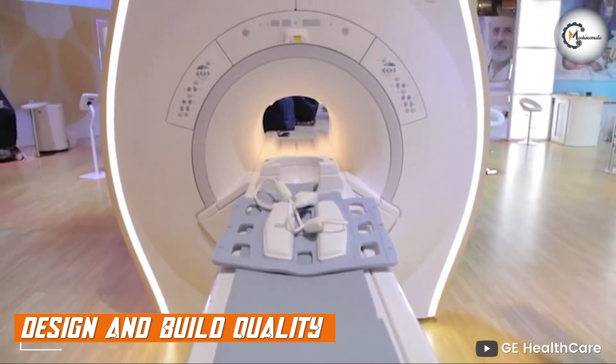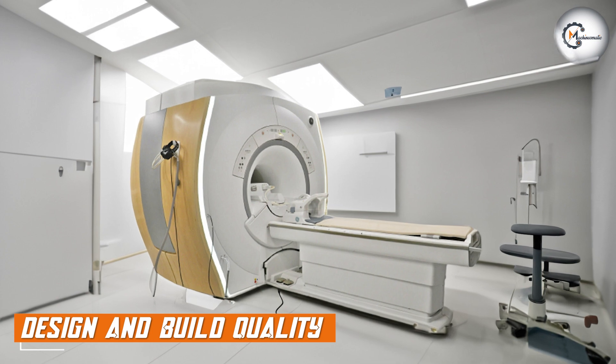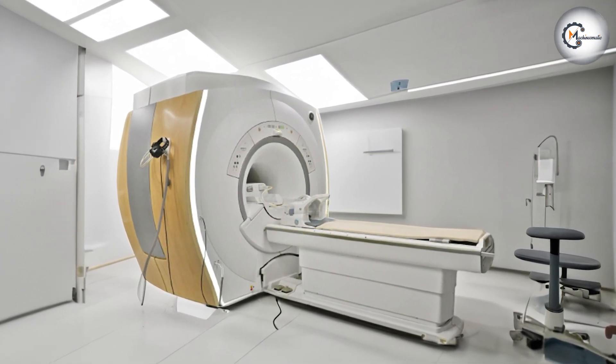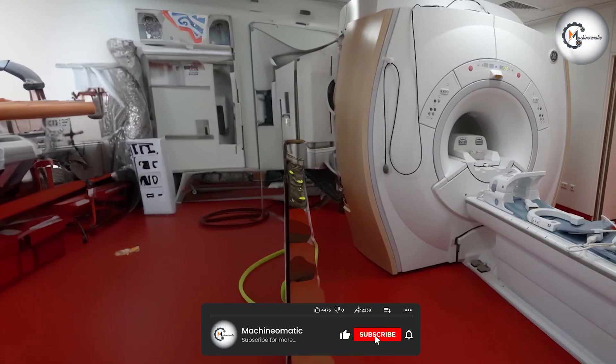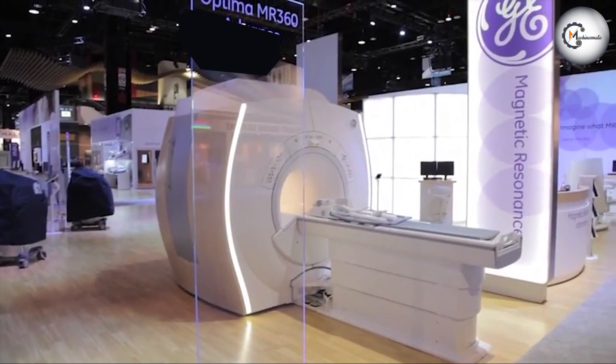Let's start with the design and build quality of the GE Optima. This MRI system features a sleek and modern design with a patient-friendly open-bore design that helps reduce feelings of claustrophobia. The system's construction is solid and durable, ensuring stability and reliability during imaging procedures.